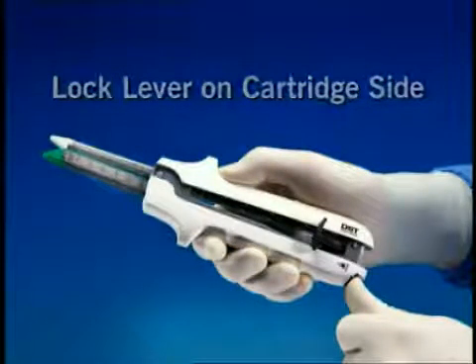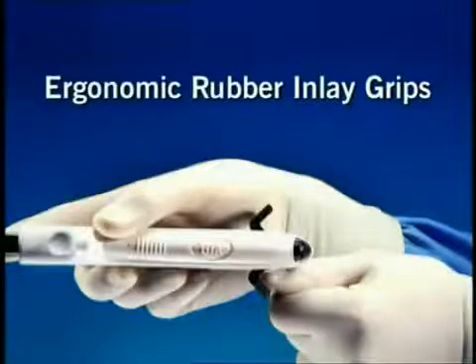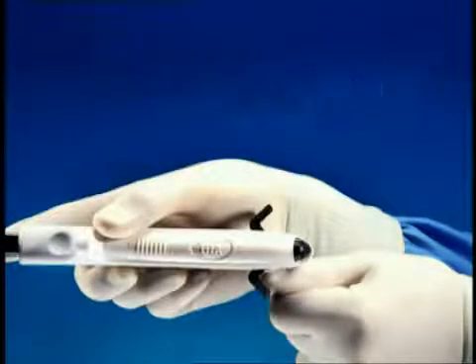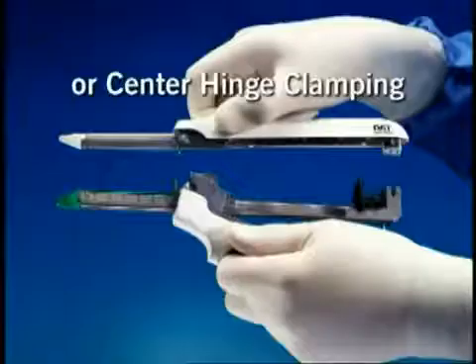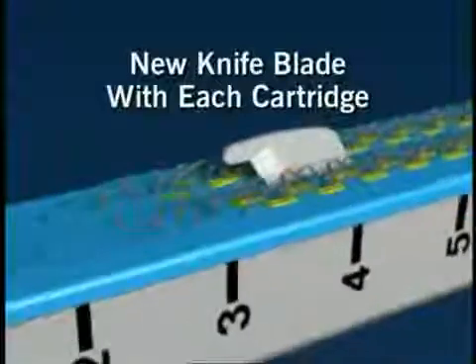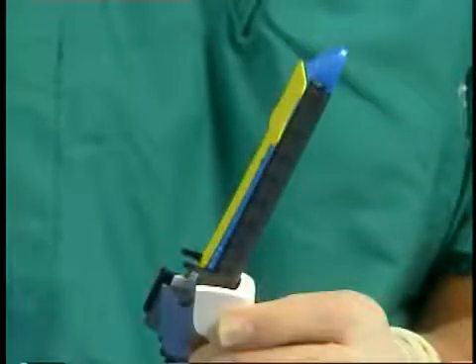The DST series GIA staplers also offer these features: a quick-release button and lock lever on the cartridge side, ergonomic rubber inlay grips, an adjustable firing knob, optional rear or center hinge clamping, and a new knife blade with each cartridge. The DST series GIA staplers are packaged sterile with one single-use loading unit, or SULU, in place.